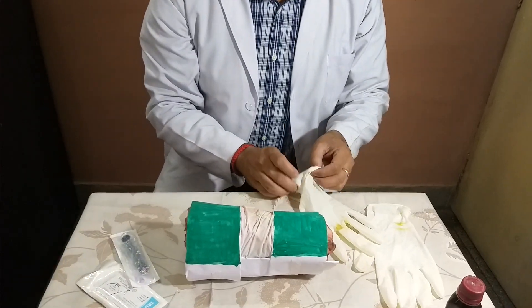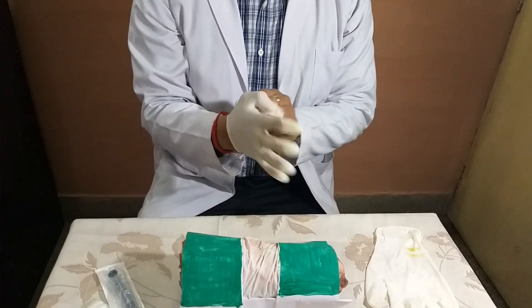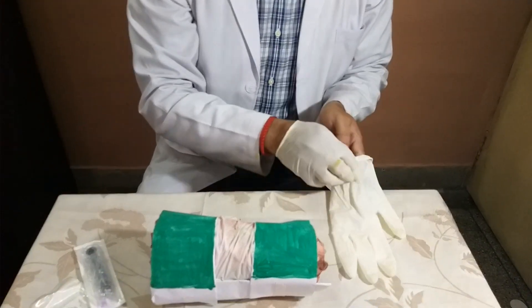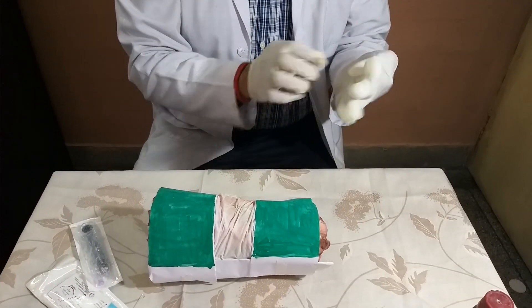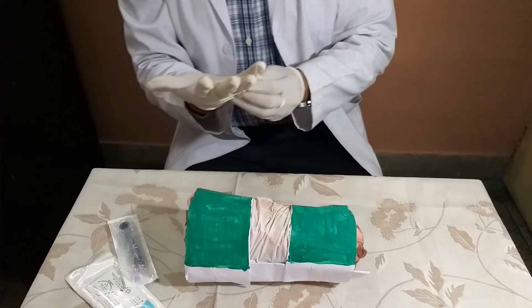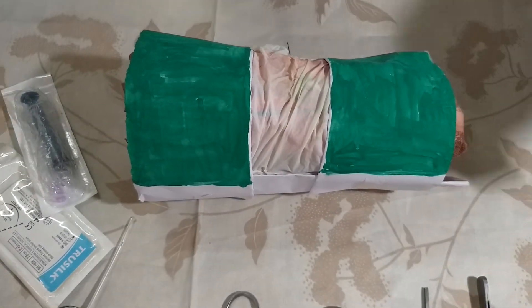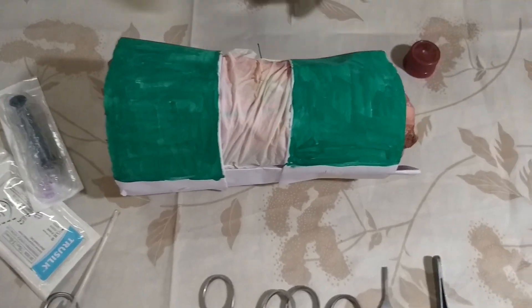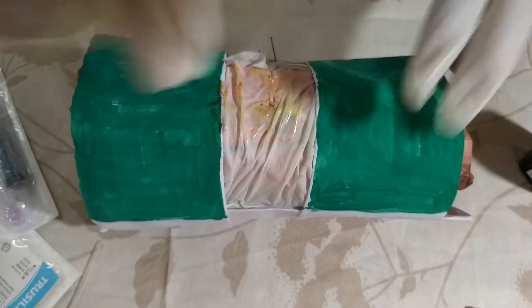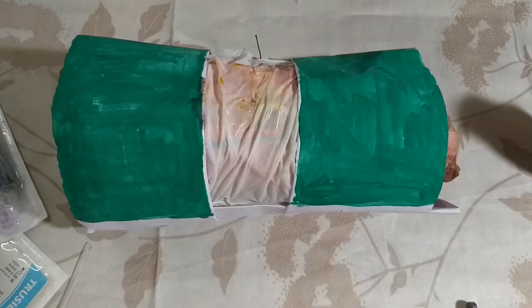I will start the procedure. First I will wear the gloves, because strict asepsis should be maintained while doing the procedure. This is our working area — here we have to work. First you have to sterilize this area with betadine; take some amount of betadine and sterilize the area. Then you put a drape sheet over the site.